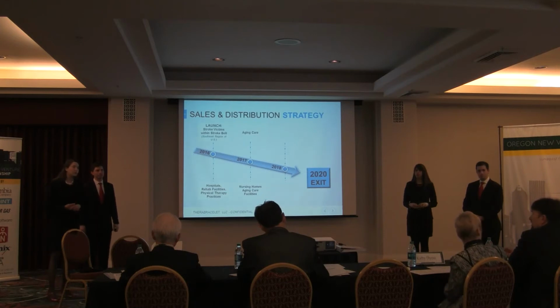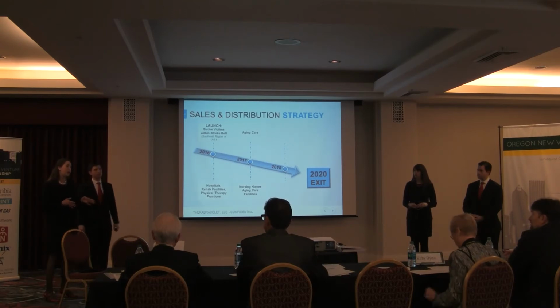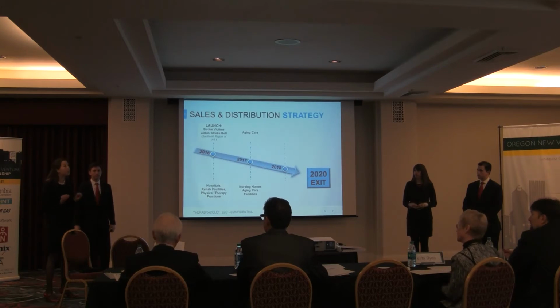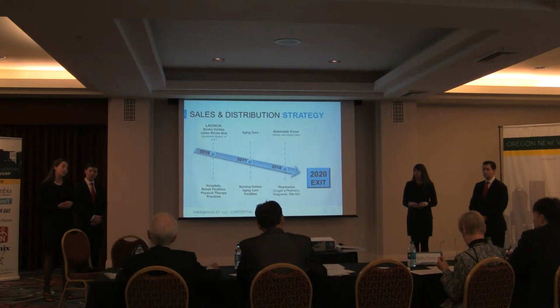What's the impact to the patient if it's not calibrated correctly? It's not going to hurt them, but they need to have the healthcare provider do it, because if it's not correctly calibrated, it's not going to work. Most importantly, if you feel it, it's not going to work. If it was calibrated a little bit too low, it will still have some impact, but we want to get it at the right spot to have the maximum efficacy. So also encouraging patients to utilize this device, we believe, is going to help substantiate a case for continued Medicare reimbursement for patients going to physical therapy by providing measurable results while they're there.